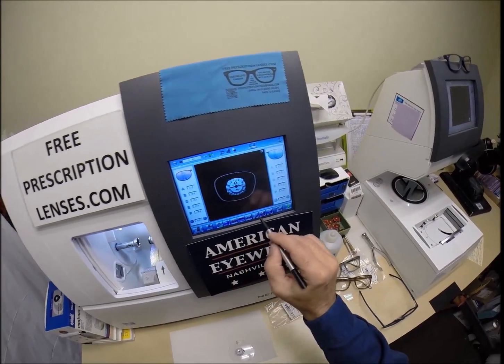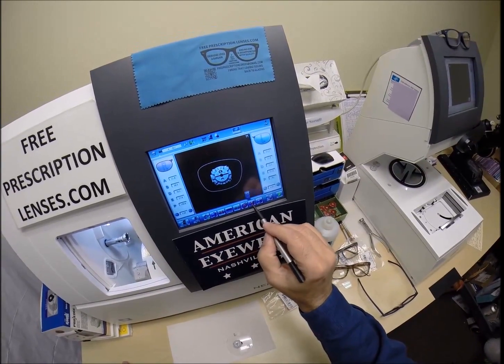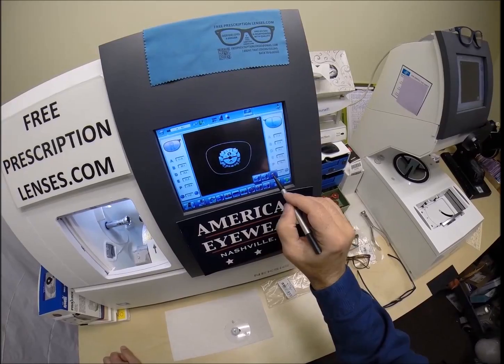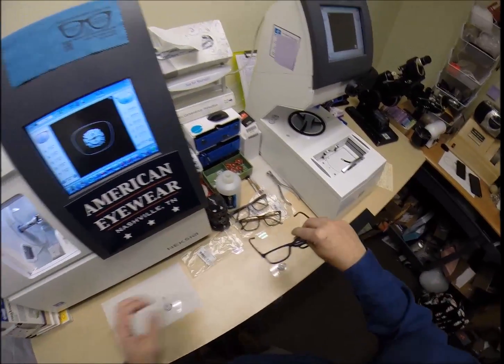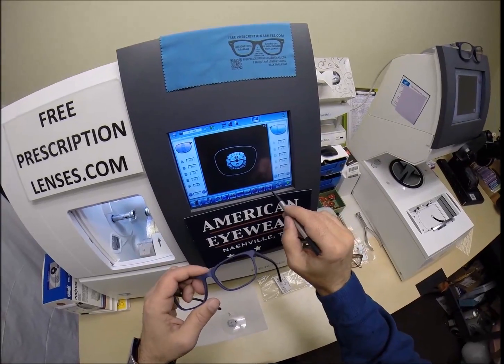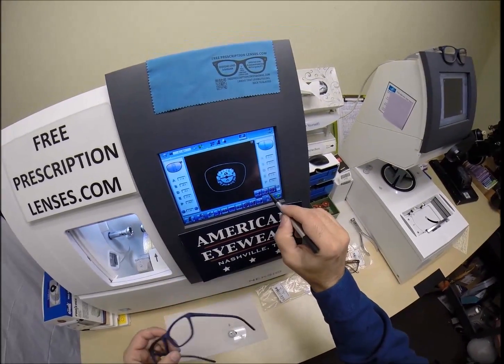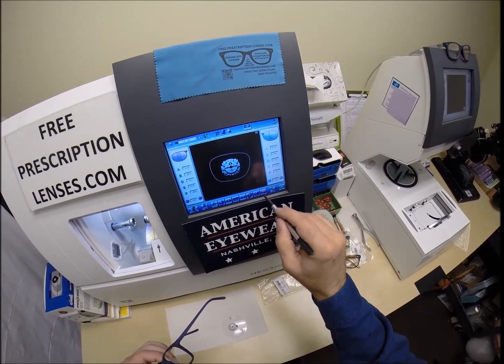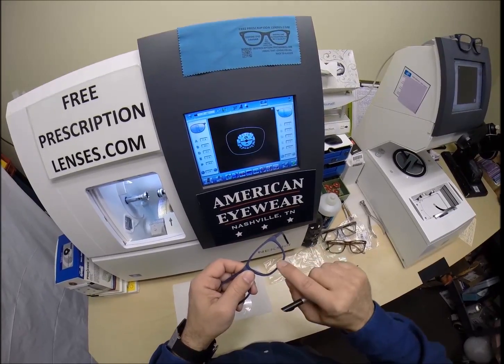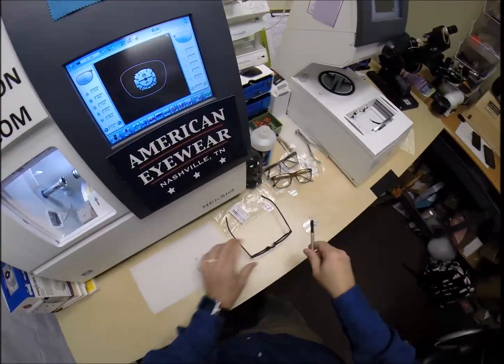But these are polycarbonate. I'm not going to polish the edge of your lenses because they're not going to be seen in this frame. I'm not going to put a safety bevel onto the front convex surface of the lens, because it's not going to protrude out of the front of the frame. And normally, I put a safety bevel on the rear concave surface of the lens, and even though that's not going to protrude out of the frame, I still do it anyway, because as I push the lens into the frame, I want the lens to be smooth against the front surface of the frame.